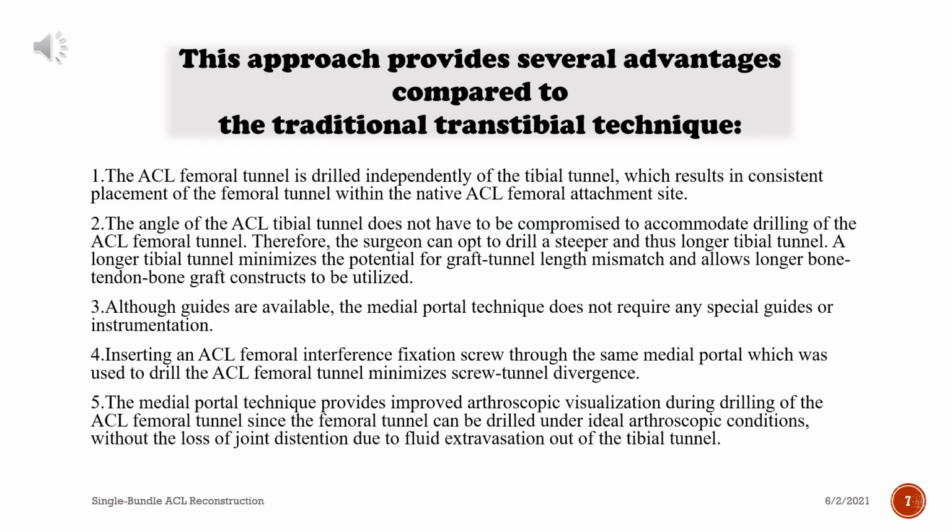This approach provides several advantages compared to the traditional transtibial technique. The ACL femoral tunnel is drilled independently of the tibial tunnel, which results in the consistent placement of the femoral tunnel within the native ACL femoral attachment site. The angle of the ACL tibial tunnel does not have to be compromised to accommodate drilling of the ACL femoral tunnel. Therefore, the surgeon can opt to drill a steeper and thus longer tibial tunnel.